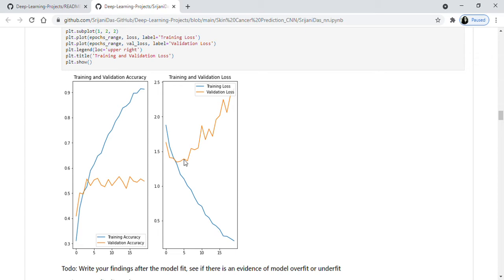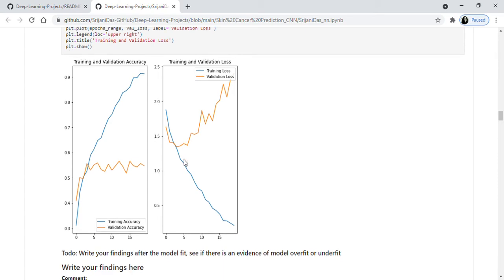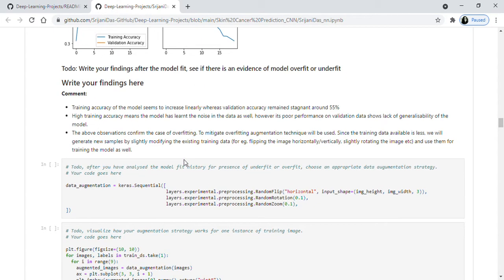So how do we overcome the problem of overfitting? One approach is data augmentation. We have very little data, and that is why the convolutional neural network is just memorizing everything — that's why it's overfitting. It's performing well on training data but very poorly on unseen data, which is the validation data. With data augmentation, we'll create more variations of the existing data so that our model has more images to train on and will generalize better.